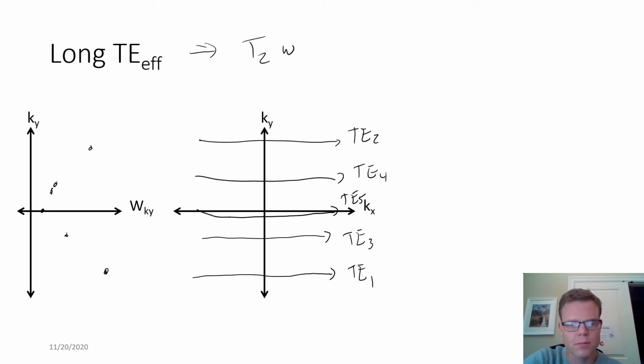And all we would do in the pulse sequence to make these manipulations is modify those phase encoding gradients such that we choose at which of the spin echoes we cover the center of k-space. So which of the spin echoes we weight the most information-rich spatial frequency data.